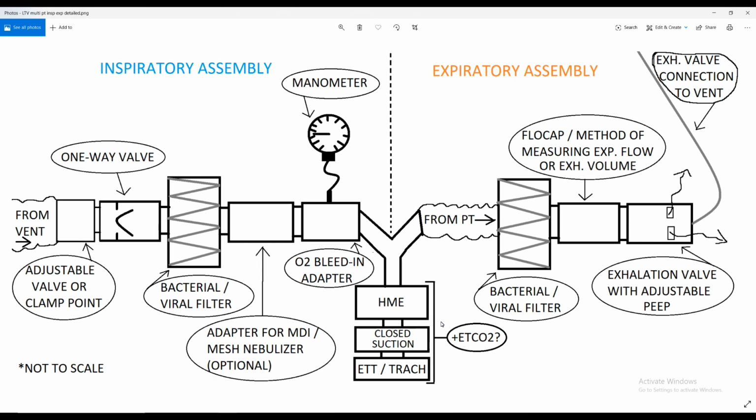So definitely, if it's feasible and your facility has the ability to throw in end-tidal monitors, we would obviously just throw those in here as close as we could to the actual patient connection without interfering with our suction or anything else. I know there's some HMEs that have a little adapter for end-tidal sampling. Just depends what you have, and then just make sure you follow your facility policy for placement of your end-tidal adapter. But end-tidal CO2 would give us even more information about what's going on with these patients, and then it would kind of take the, well, I wouldn't say entirely eliminate the need for volume monitoring or flow monitoring, but it would be another excellent tool to have.